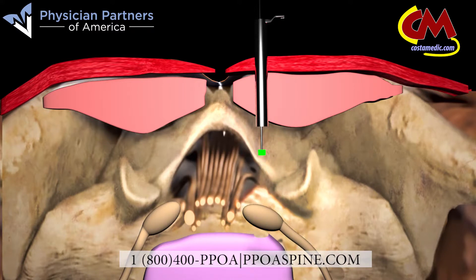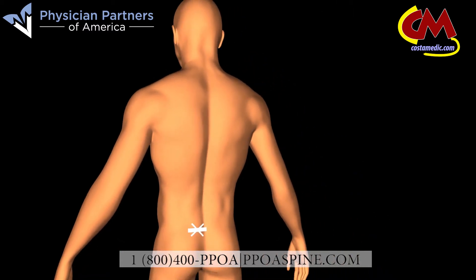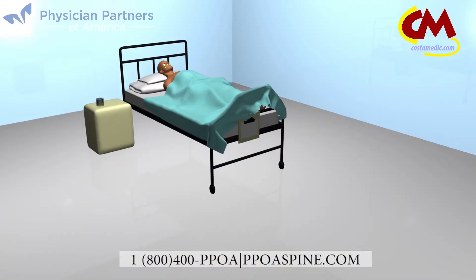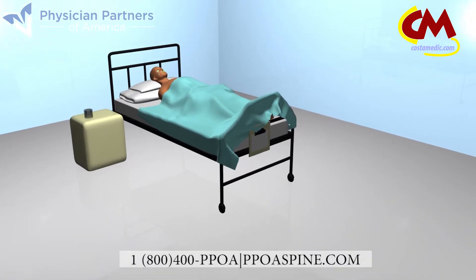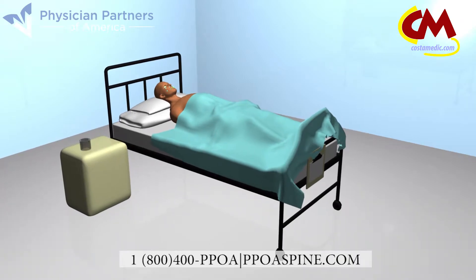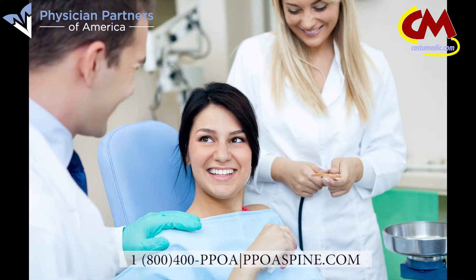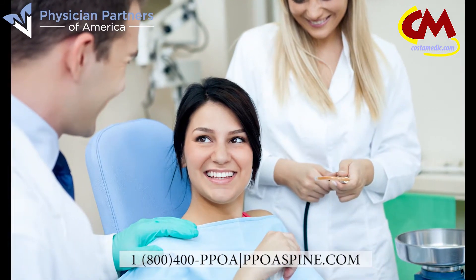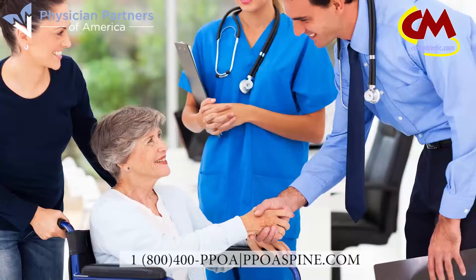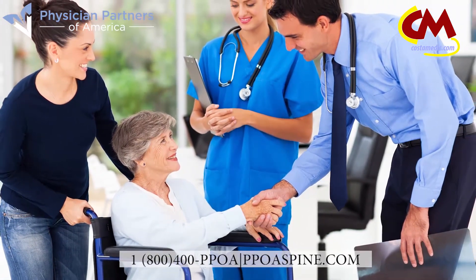The physician will then remove the dilation tube, allowing the muscle to return to its normal state, and the incision is covered with a couple stitches and a small bandage. You will spend a few hours in our comfortable, state-of-the-art ambulatory center as the effects of the anesthesia wear off. Most patients experience an immediate reduction in pain and are able to walk out of our care center and return home within a few hours, as opposed to spending days in the hospital recovering from traditional discectomy surgeries.